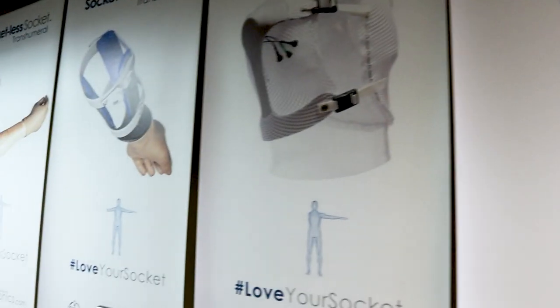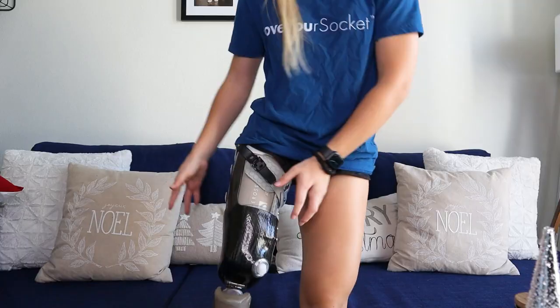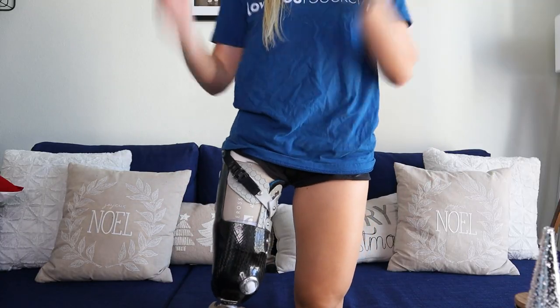For my non-amputees out there, a socket is this part — it's the part you wear. It's the part that your stump goes into to wear your prosthetic.